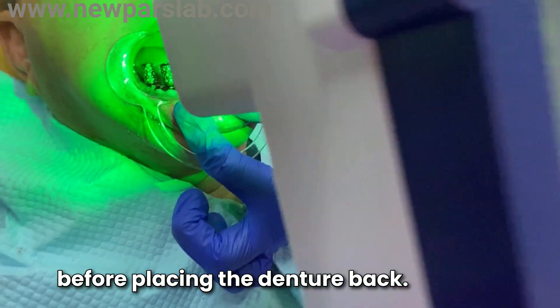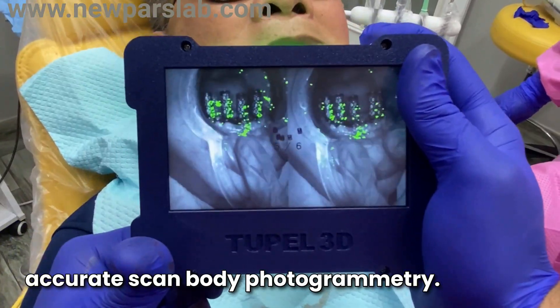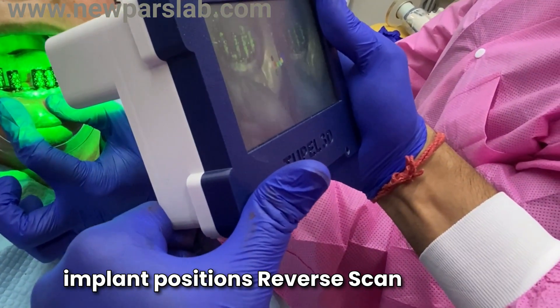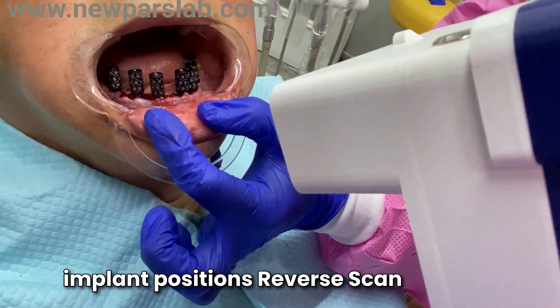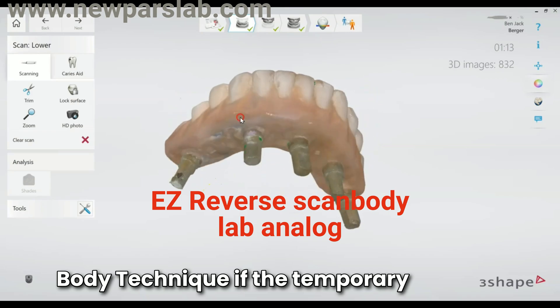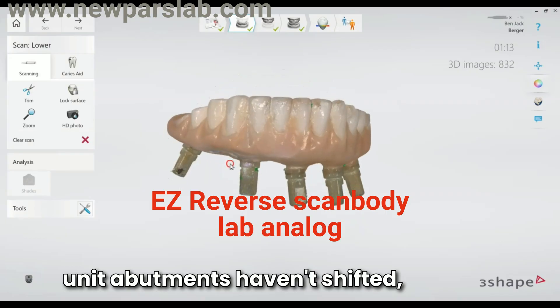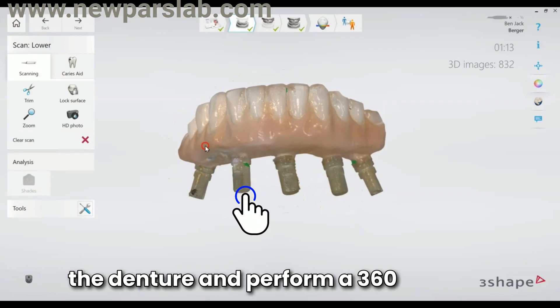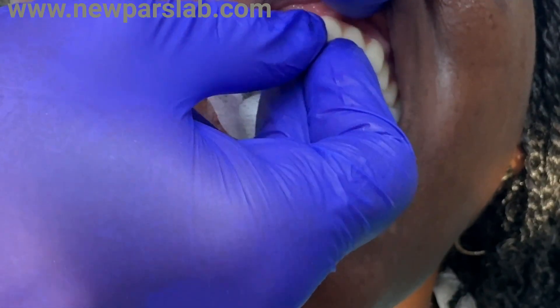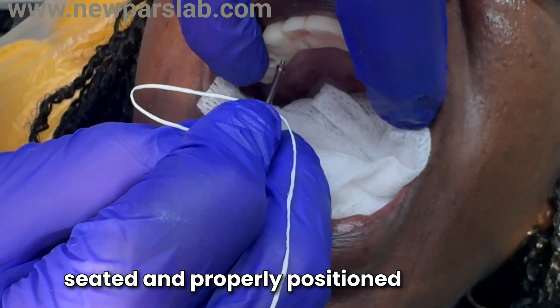Before placing the denture back, there are two options to ensure accurate scan body positioning: photogrammetry scanning for precise capture of implant positions, or the reverse scan body technique. If the temporary denture fits well and the multi-unit abutments haven't shifted, place the reverse scan bodies on the denture and perform a 360-degree scan.